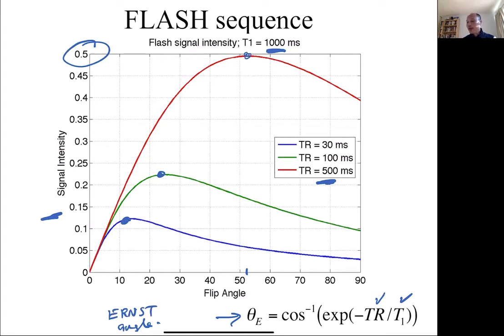And for example, for a 90-degree pulse, if I had to wait 3 T1s, let's say 3 times T1, then that would be about 3,000 milliseconds, right? So to wait for things to recover. Whereas in this case, I'm only waiting 500 milliseconds between lines. And so with this type of sequence, you can go much faster. And so you'll see a lot of these types of sequences in clinical use and even research use, just because speed is always an issue when we're doing MRI or any type of clinical exam.